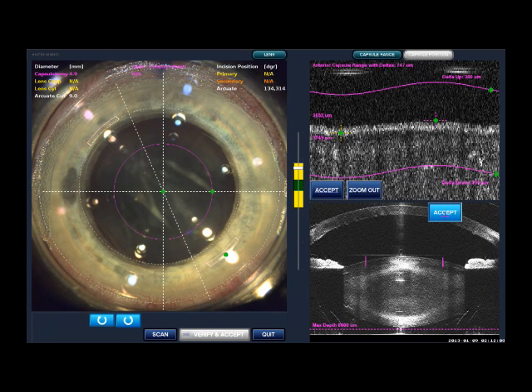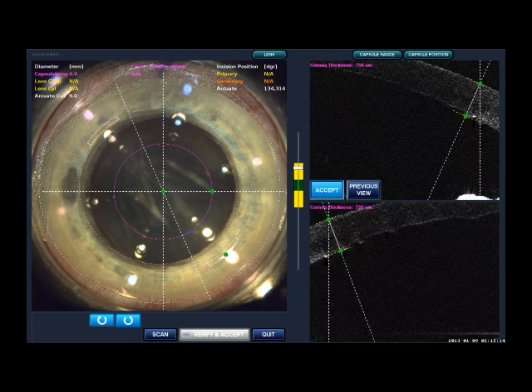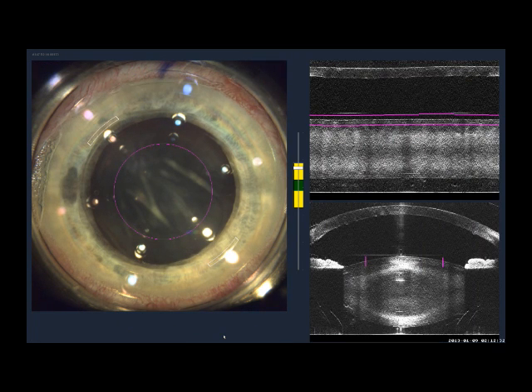On the upper right side of the screen we see an OCT image of the anterior capsule, and utilizing advanced imaging, the laser starts planning out a portion of the procedure for us, and we either accept what we are presented or we can make adjustments, as you see here in the upper right image. The purpose of this portion of the procedure is to make relaxing incisions within the cornea to correct astigmatism.